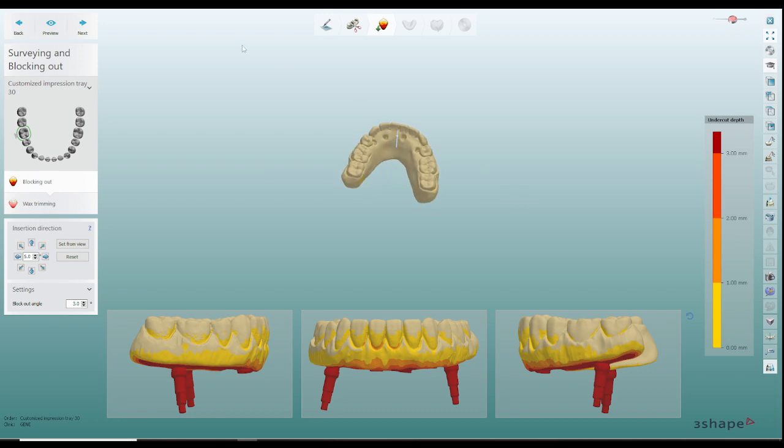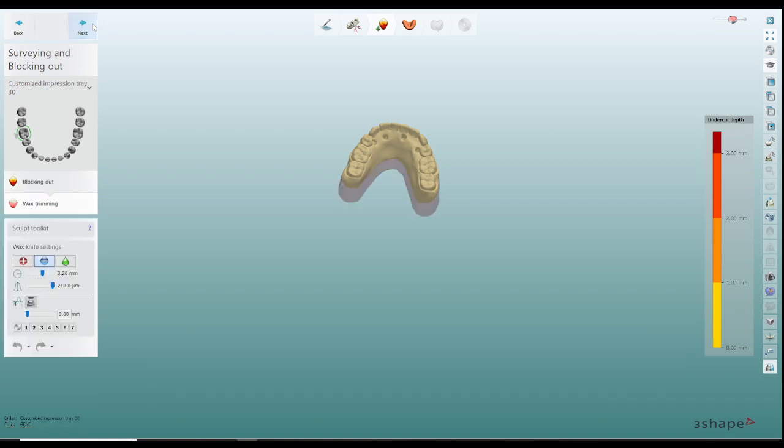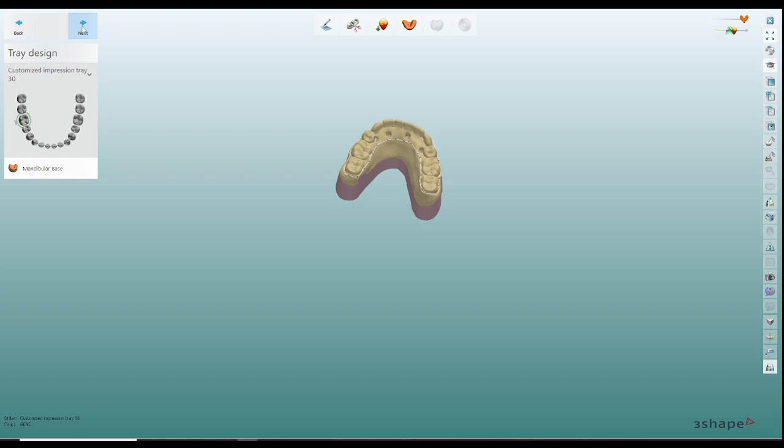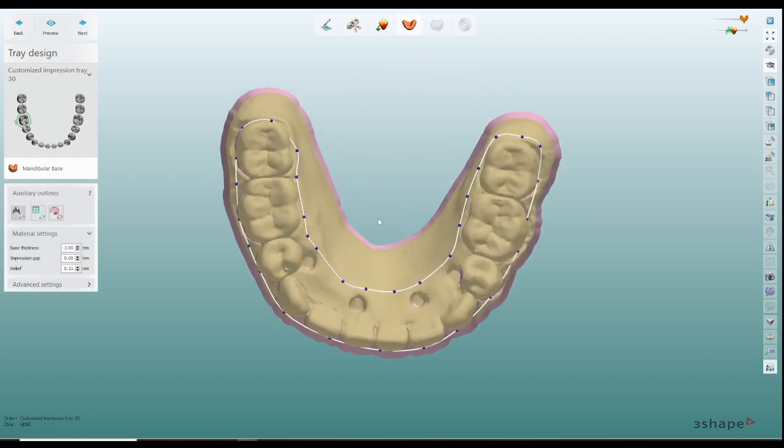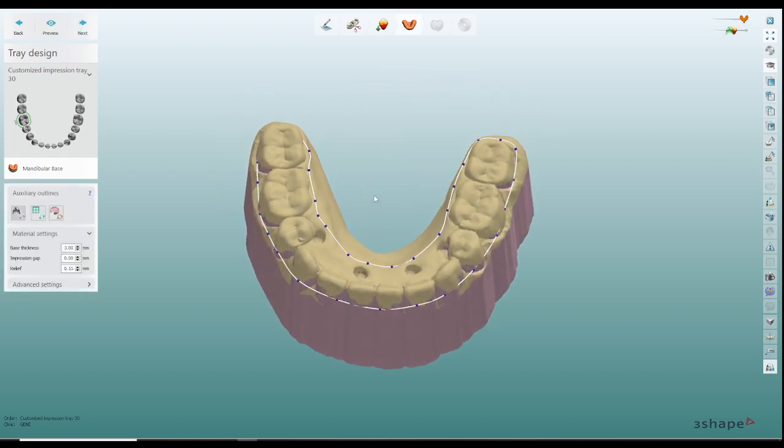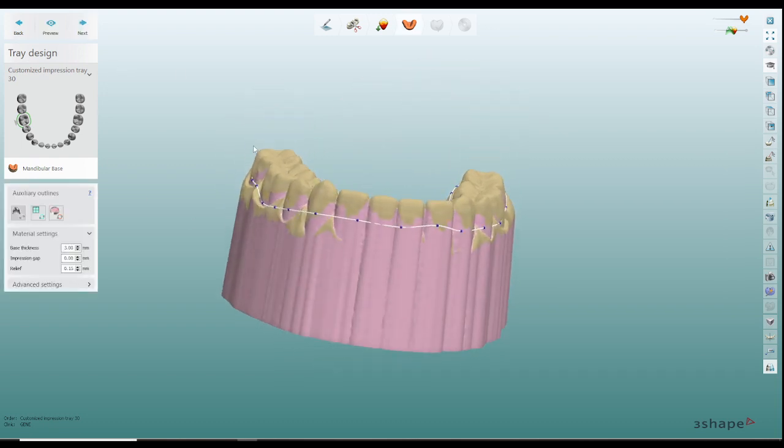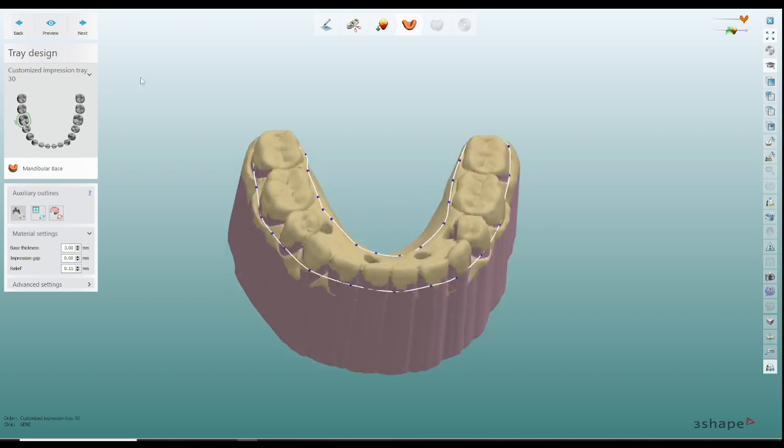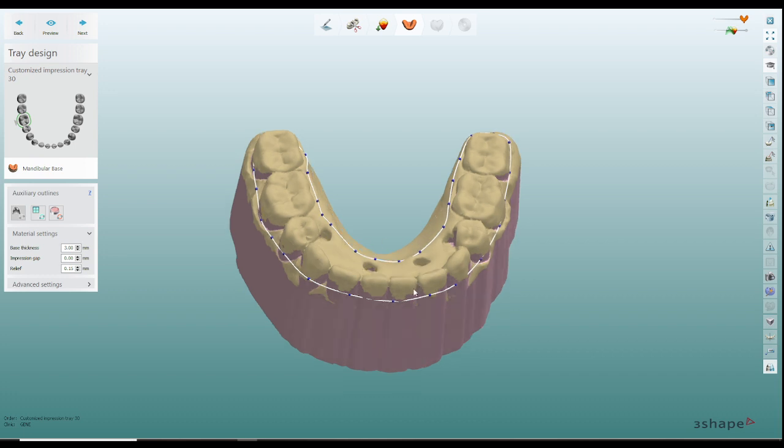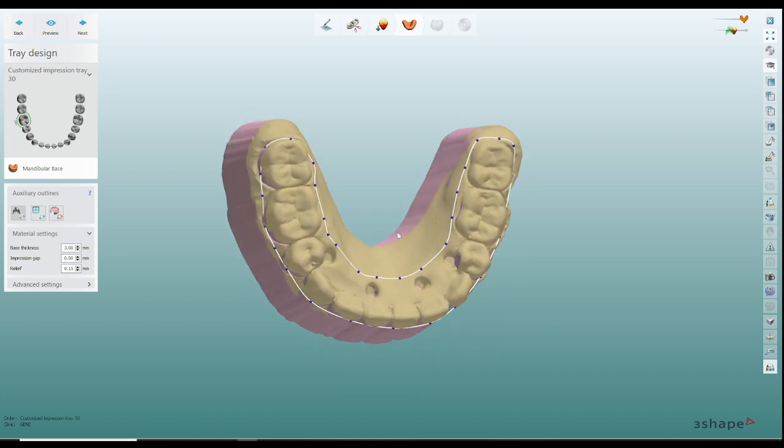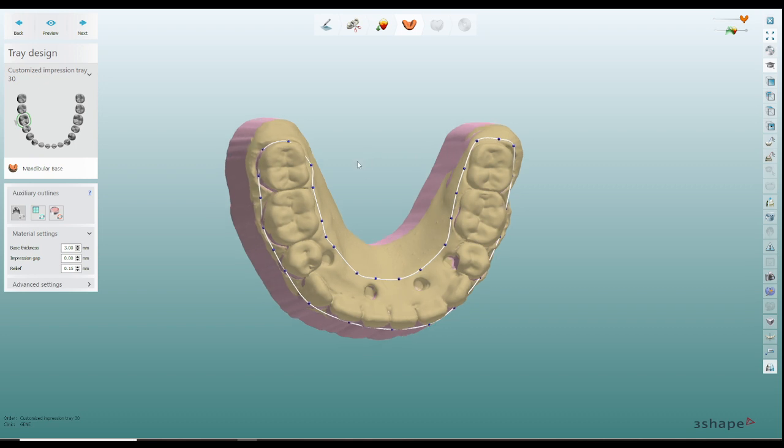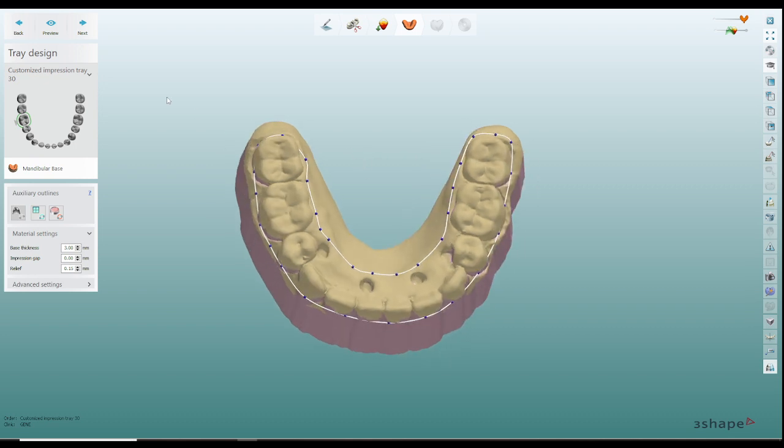Once I got it all scanned in I bring it into the 3Shape custom tray module. I'll do a block out then I'll do the outline, pretty basic outline nothing special here just to cover the teeth and I want to make sure that's about three millimeters thickness just so it has a bit of strength to it because it makes it a little bit more stable. You can do two millimeters, you can do two and a half, I usually do three.